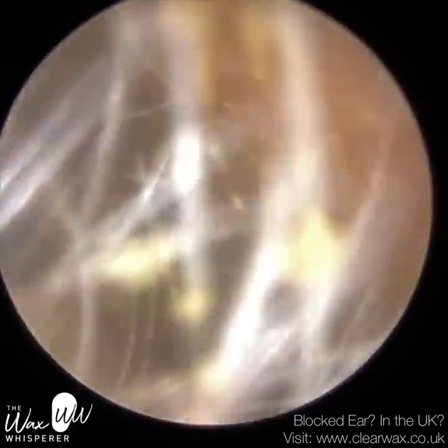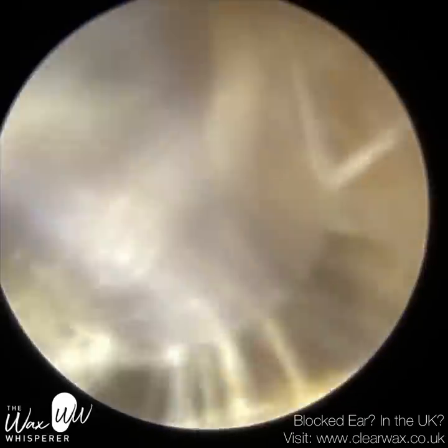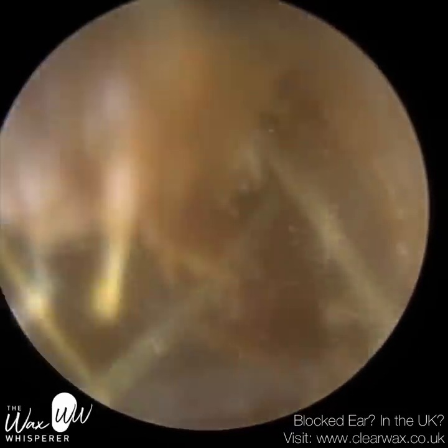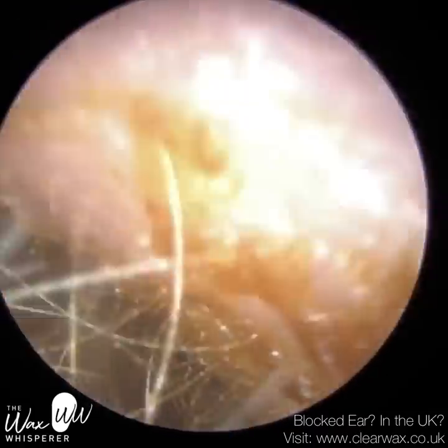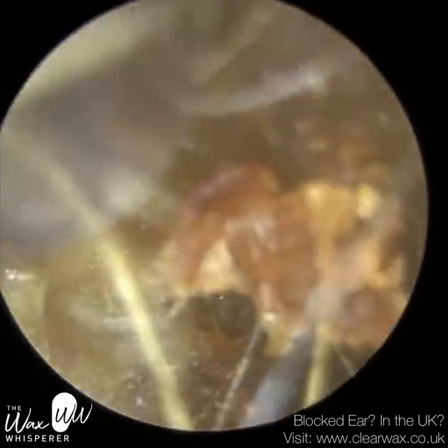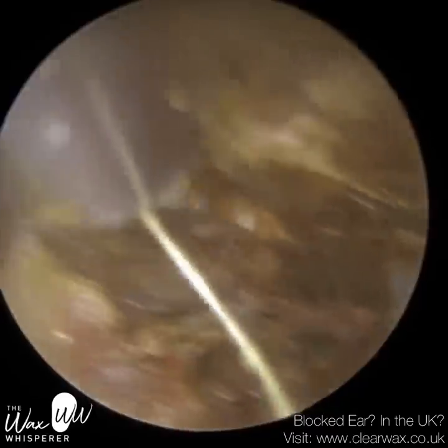I've now removed probably the outer centimetre's worth of earwax and I can go in a bit further with the endoscope. You can see that consistency — it's almost like butter, this midsection. The innermost layer of the wax and dead skin is a bit firmer and it's attached to the eardrum. The reason why I think the patient may have early stages of keratosis obturans is because they do have a bit of granulation tissue at the roof of the ear canal, hidden behind this wax and skin plug. There's also a high content of dead skin — you can see that dead skin on the outermost layer.